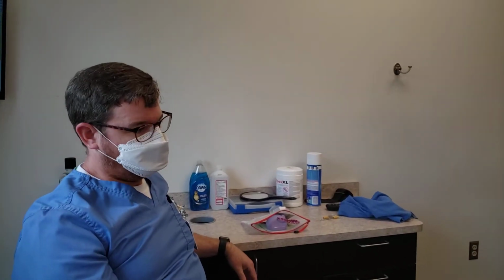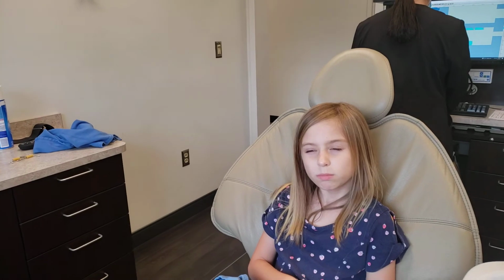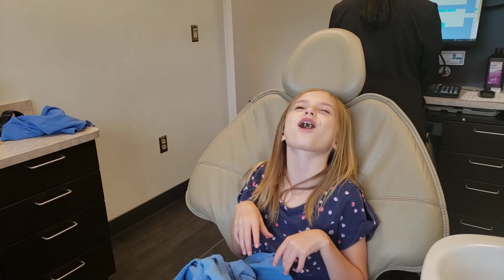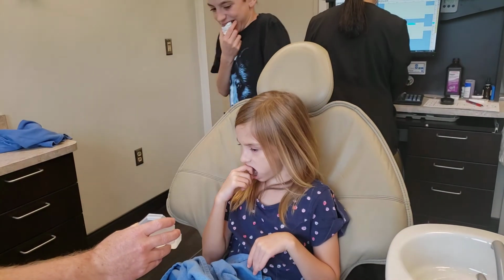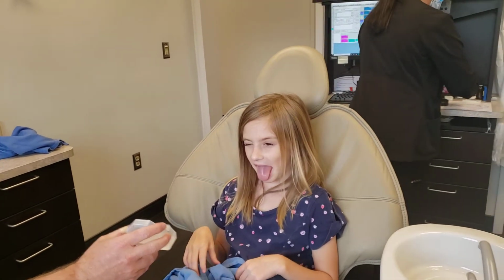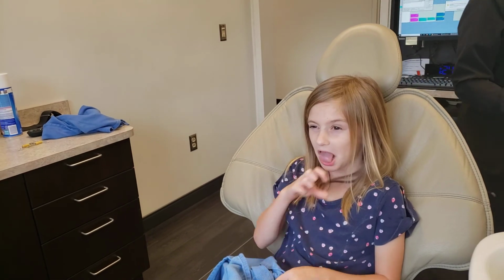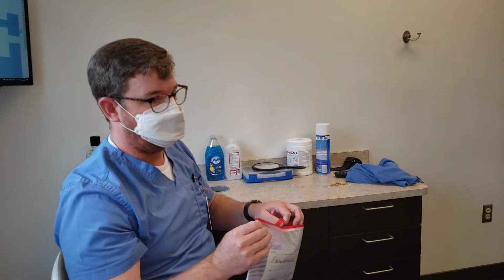And then both of them use habit trainers at night. Okay, we can do this, guys. We've got lots of practice. You can put it back in here for right now. And when it's not in your mouth, it needs to be in the case. You may want to go home and use your toothpaste to clean it, to flavor it. It's just that new taste.